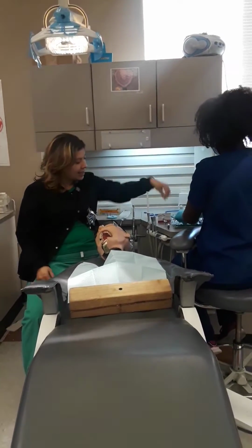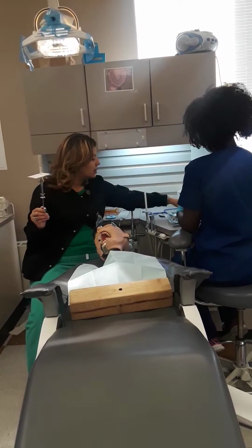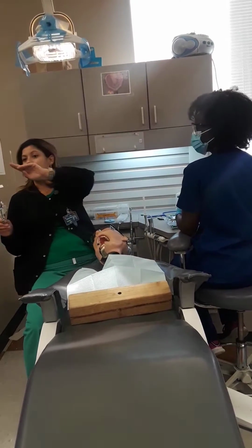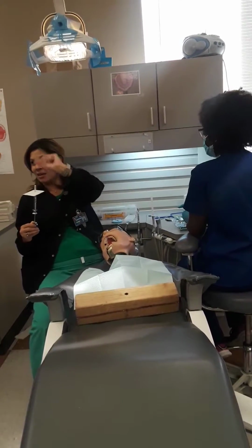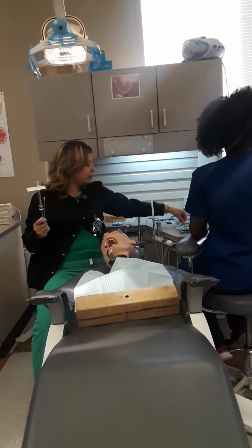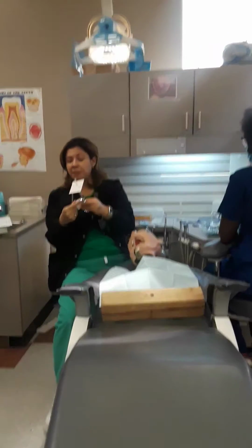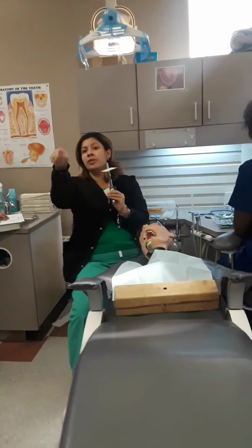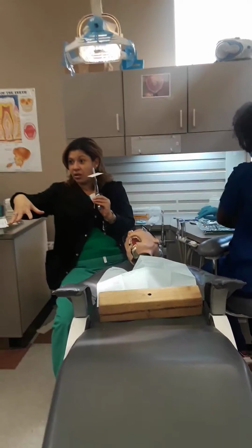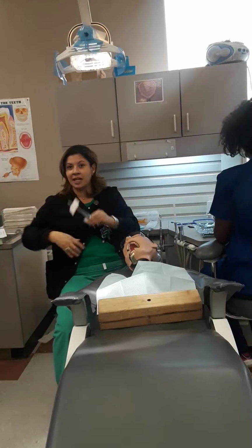When they said anesthetic setup, we basically get our syringe and this has topical gel on it. We just pretend that it's there. And then we use a gauze, and then I'll explain why. So this is the setup for that. And everything is color coded. Everything in your instrument should be all blue. So when we go into sterilization, you could just toss it in there. And then once you start bagging it, you put all the blue instruments together.